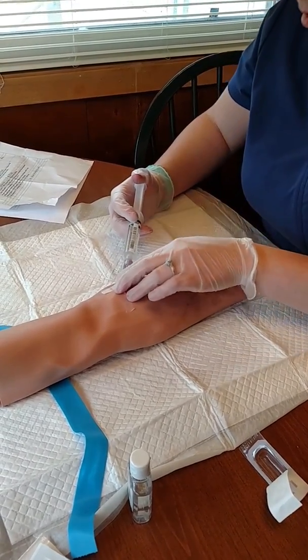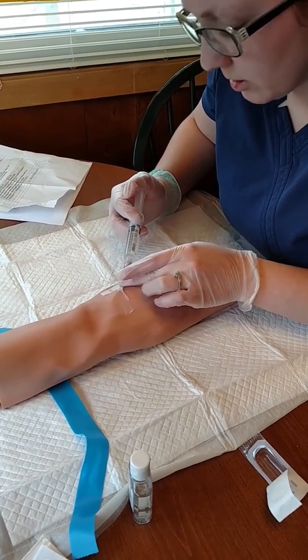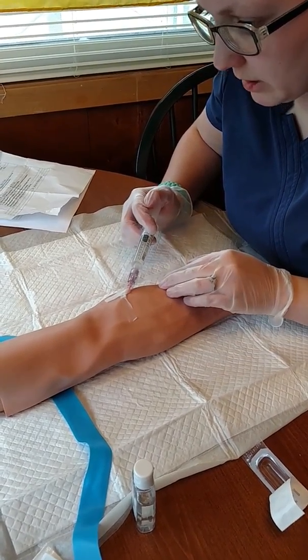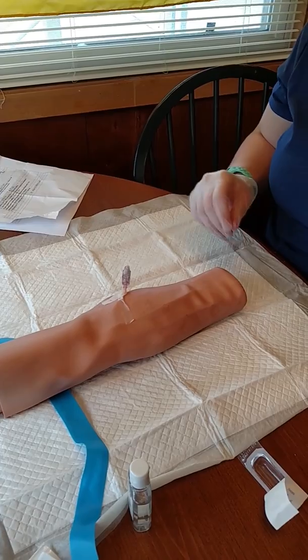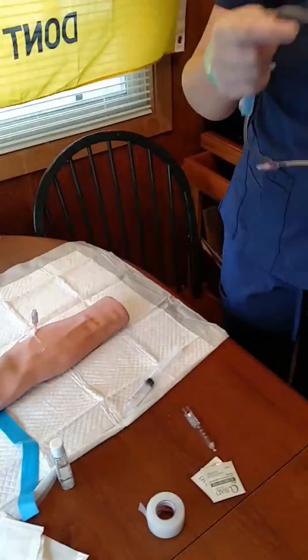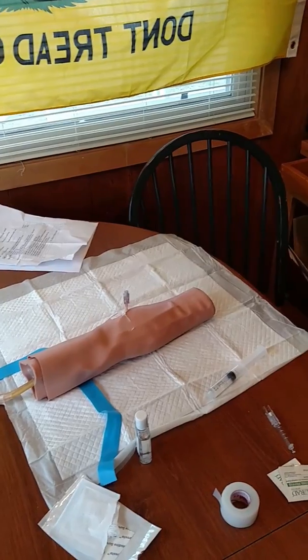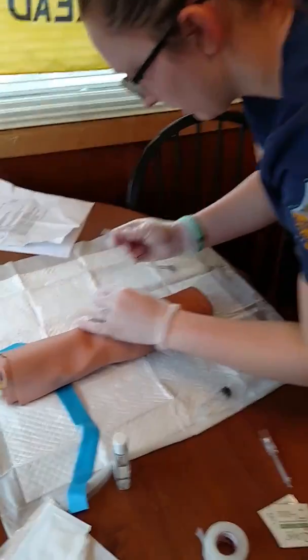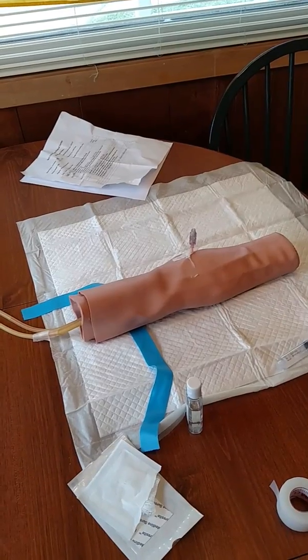Just do a few cc's here of saline. Make sure there's no infiltration. Make sure I made it in the vein. Alright. So disconnect that here, and now we're going to get the IV hooked up and going. And this is still sterile since I kept my cap on. And I would just alcohol this just to be safe in case it's touched anything from now to then.